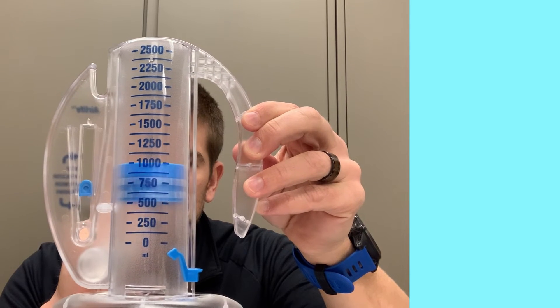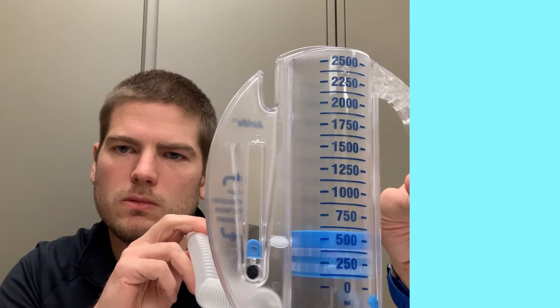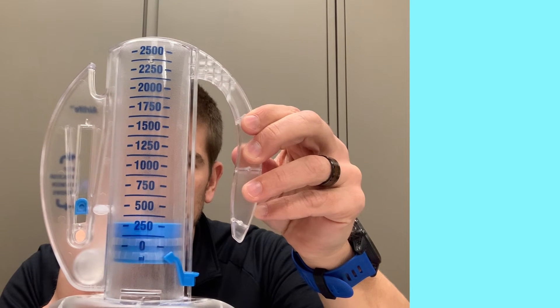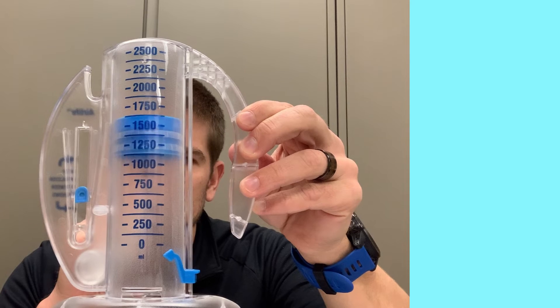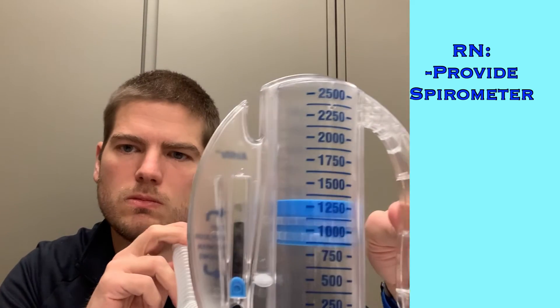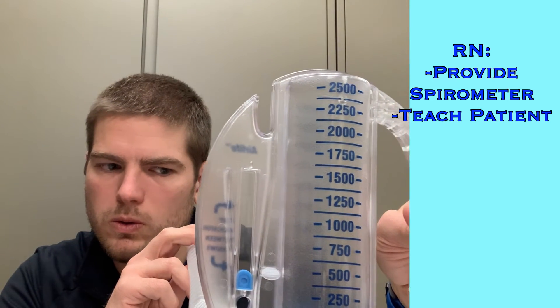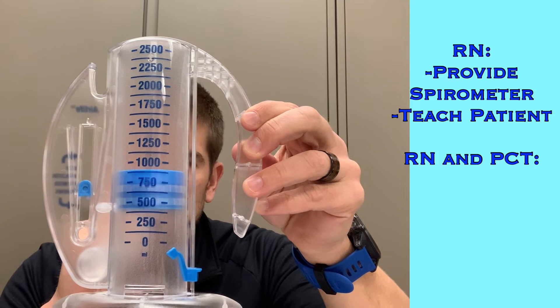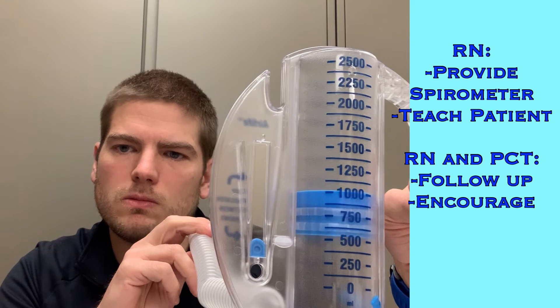The use of the spirometer and encouraging regular deep breathing can retrain the lungs to function at full capacity — so it's important! Neglecting the lungs with these diagnoses can lead to life-threatening complications. As a healthcare worker, know what types of patients will benefit from this device. When ordered, it is the responsibility of the nurse to provide the patient with an incentive spirometer, train the patient on how to use it properly, and teach them why it's important.